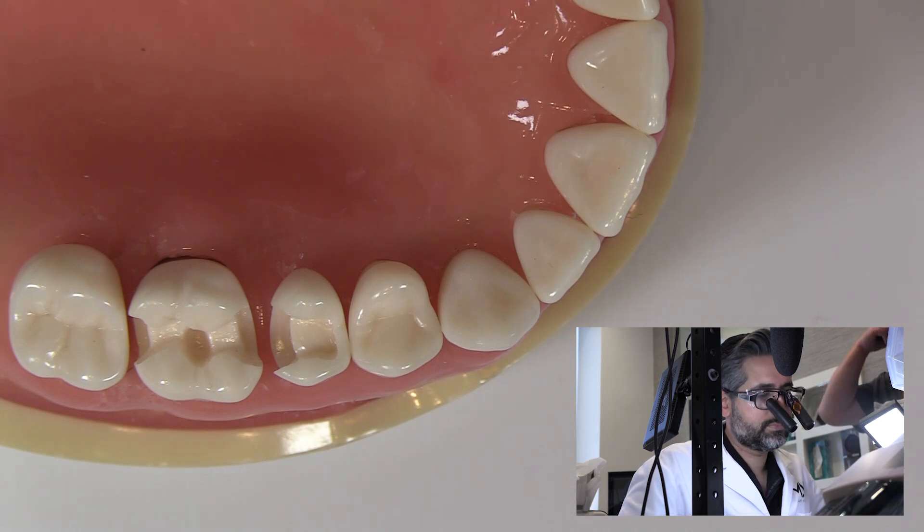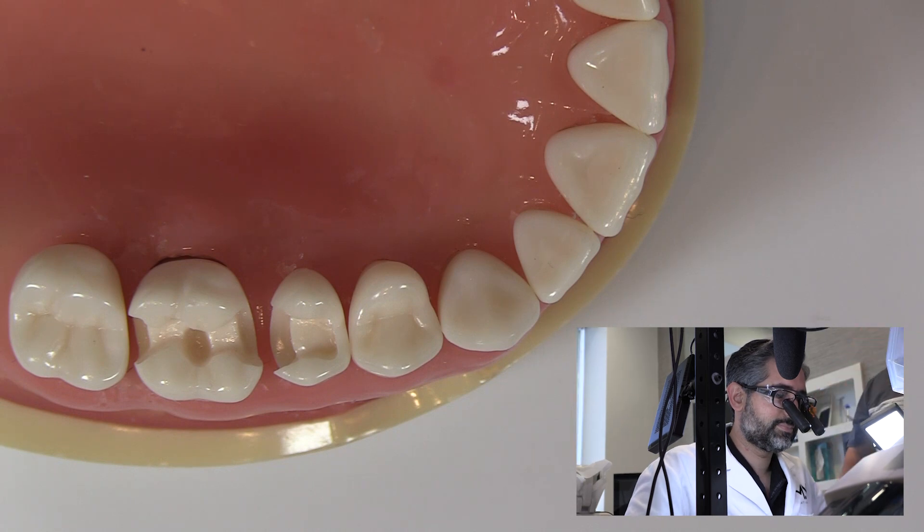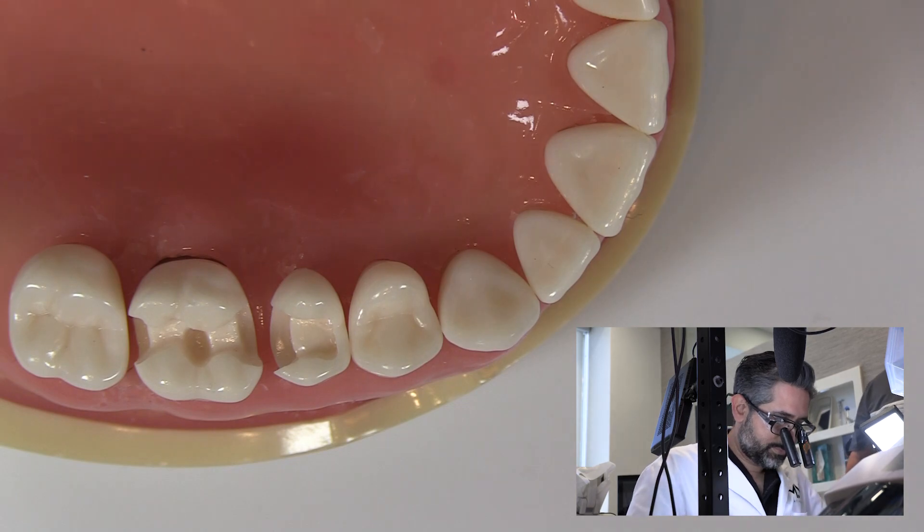Hi, this is Kevin with Garrison Dental and we are in the office of Dr. Matt Njad in beautiful Beverly Hills, California. Dr. Matt is going to tackle effective methodology for restoring back-to-back restorations. There are a lot of different ways and we thought we'd have Dr. Njad share his with us.